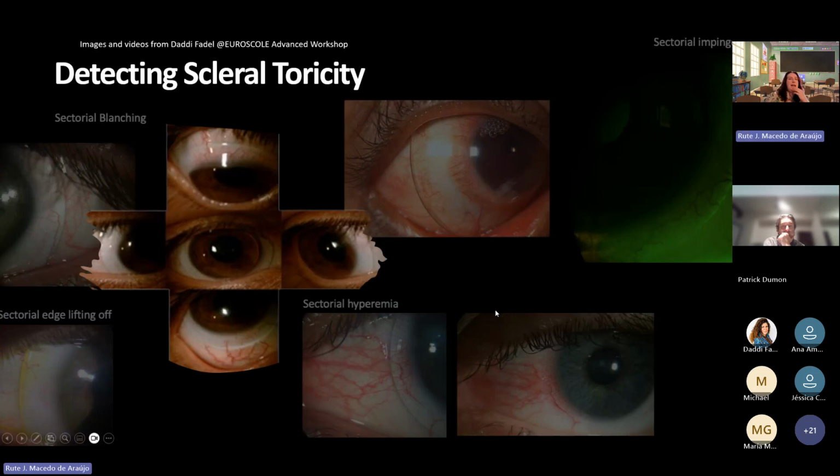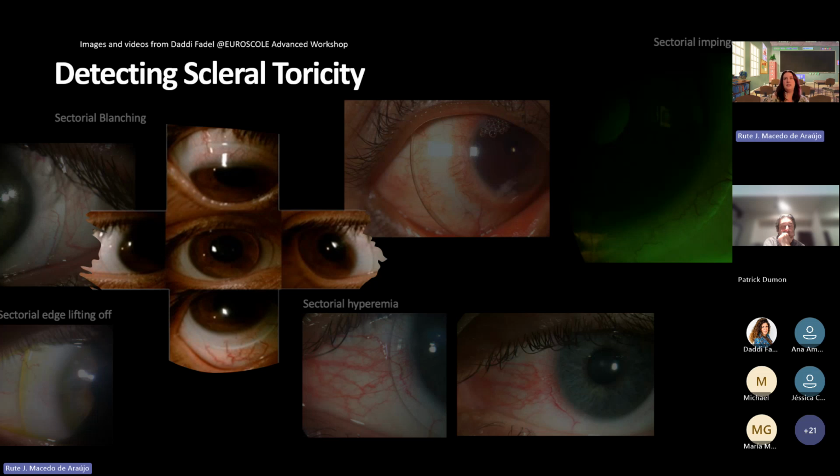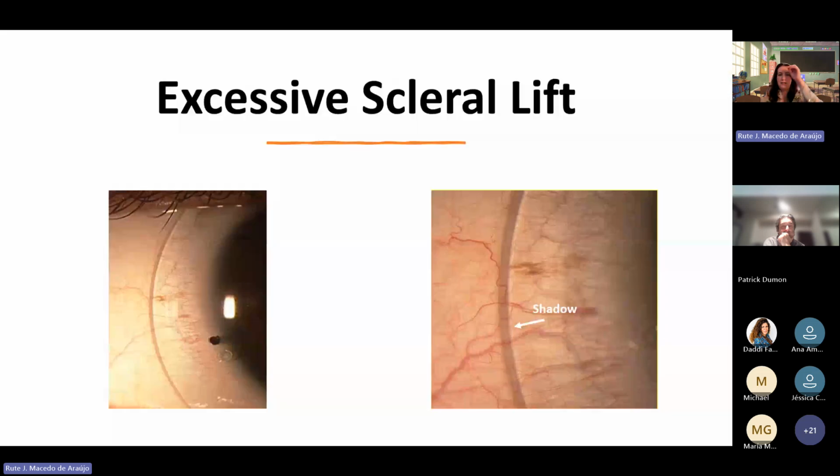And yeah, so I talk about that. So, detecting corneoscleral toricity when inserting a spherical lens. With the slit lamp, we can see when the lens is lifted, we can see this shadow here when we do a tangential observation, or tangential illumination, with that device.